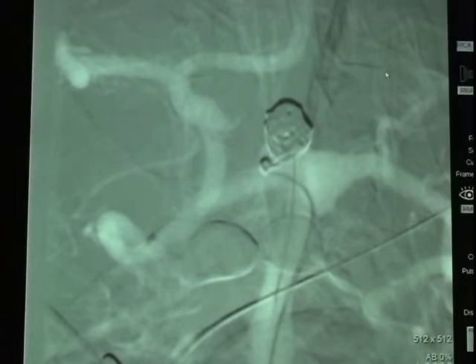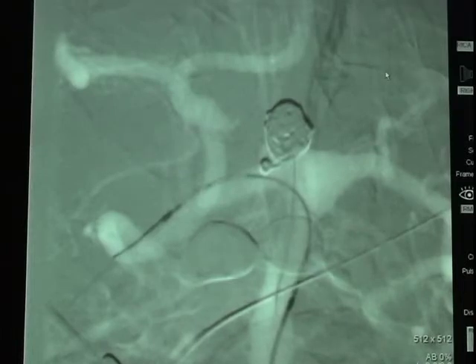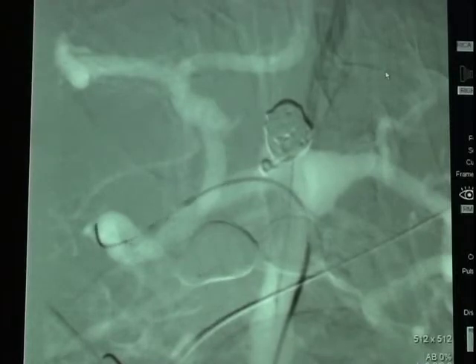Here the neck remodeling device or stent is being advanced through the second catheter. As we deploy the stent by pulling the catheter out and releasing the stent into the vessel, we will intentionally leave the more proximal end of the stent out of the basilar artery and in the apex, so that the stent actually runs from the right posterior cerebral artery into the left posterior cerebral artery.